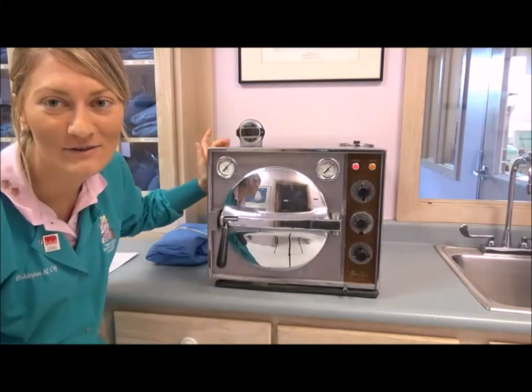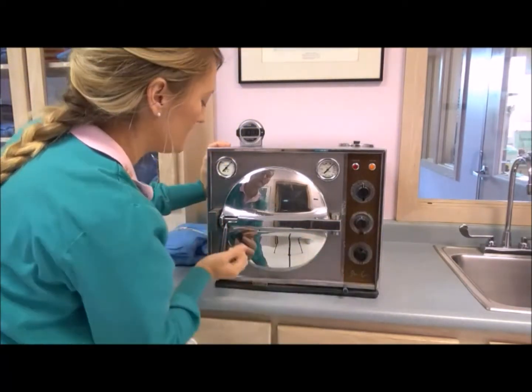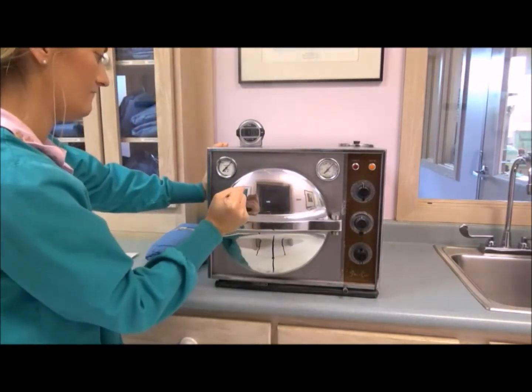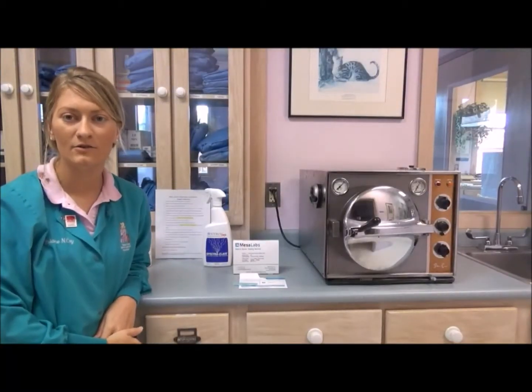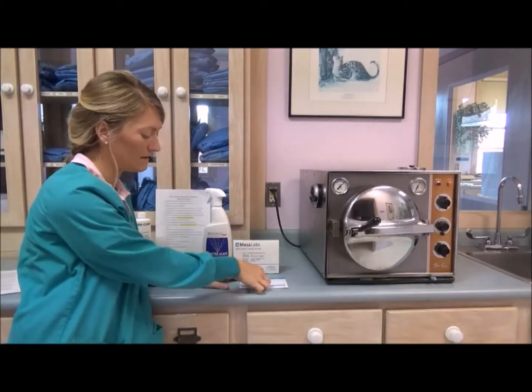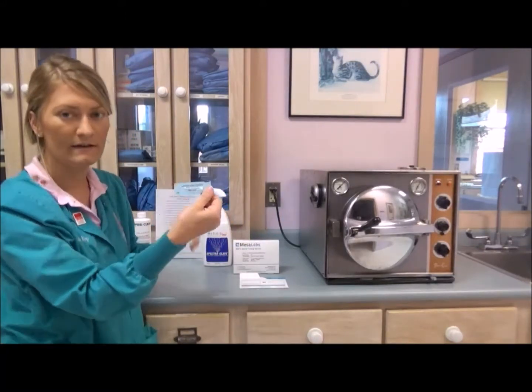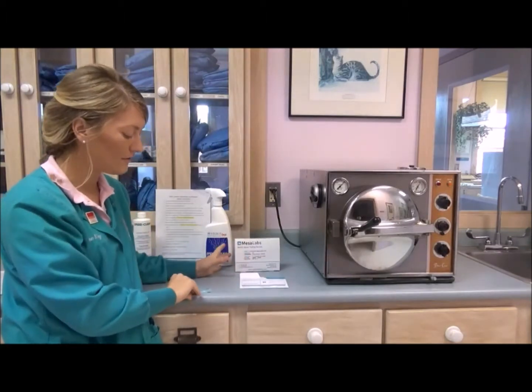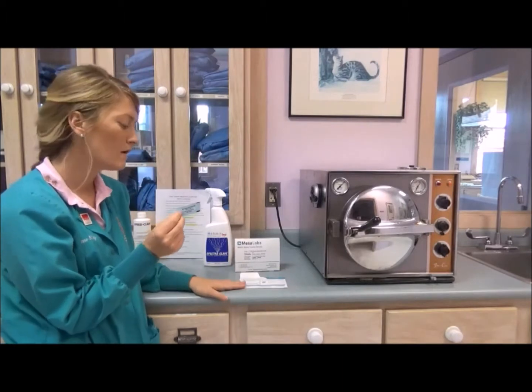So then once done, the door should be allowed to properly vent for about 10 to 15 minutes. It's important to run routine maintenance on your autoclave. So once a month, we actually run a bacterial spore test strip in our machine here, and then we send it out to Mesa Labs, where they then verify whether or not the test strip was properly sterilized or not.